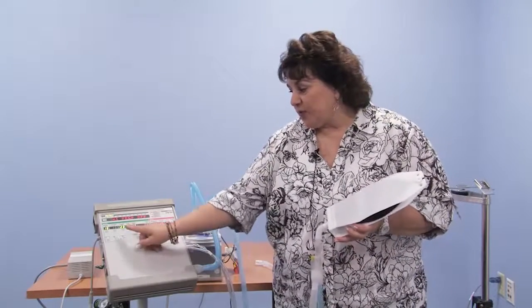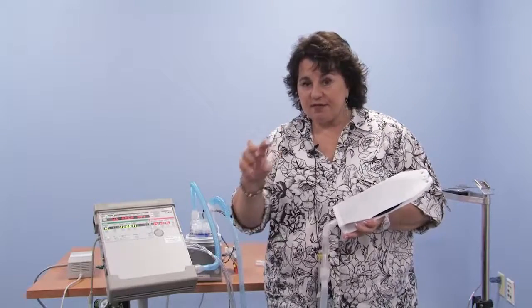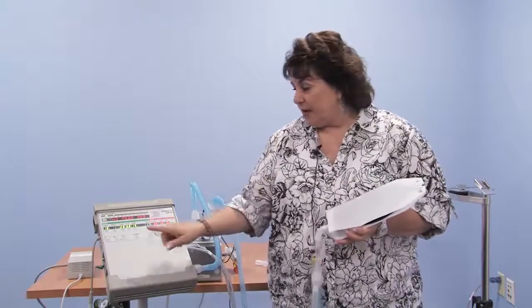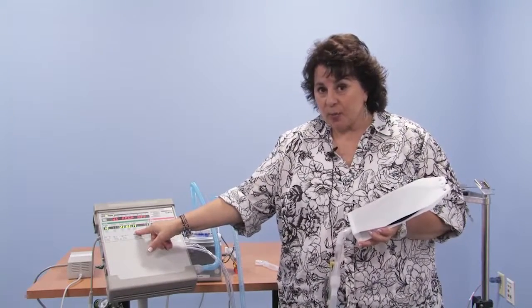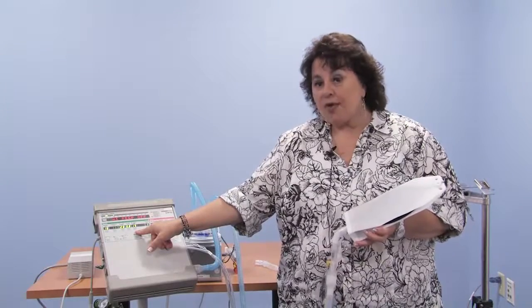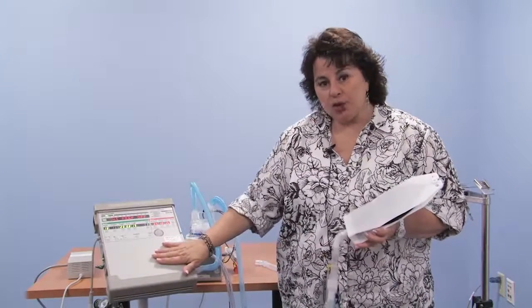So these breaths, when you set a pressure breath or a pressure support breath, it goes up to 20 and down to the external PEEP of 5, a difference of 15 centimeters of water. For the pressure support, the doctor ordered for your child to get 10 centimeters of pressure support above the 5 of PEEP. On the 950, we set the 15, the top number, and the 5, the bottom number. That's because you're setting the PEEP on the hose, and the LTV doesn't know what you set the PEEP at because it's external. That's the major difference, and that's where the most confusion is with the LTV series ventilators.